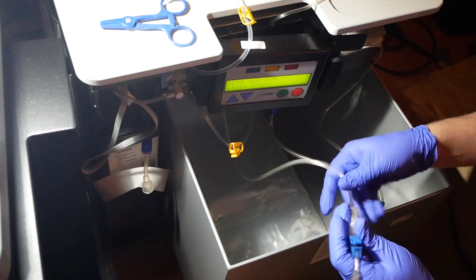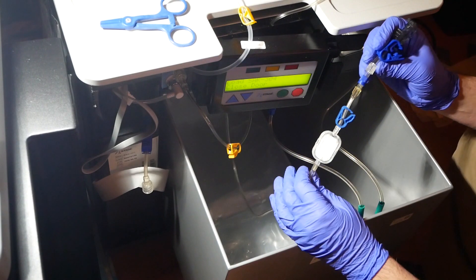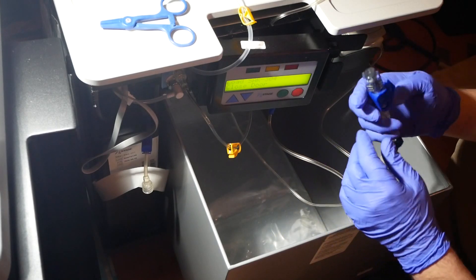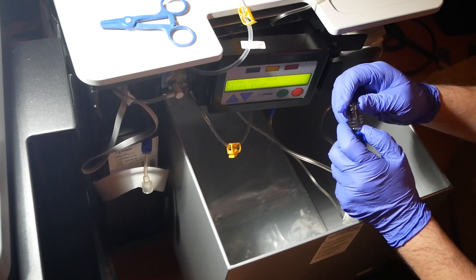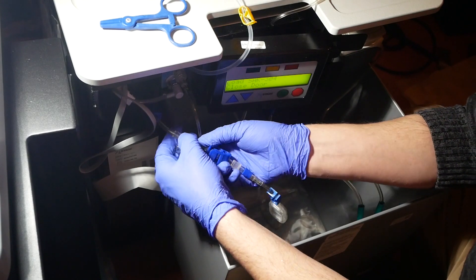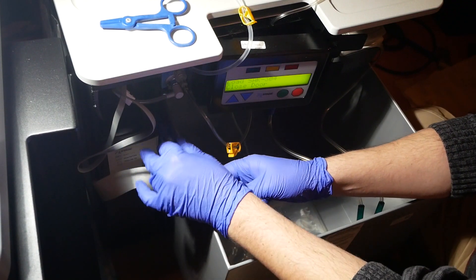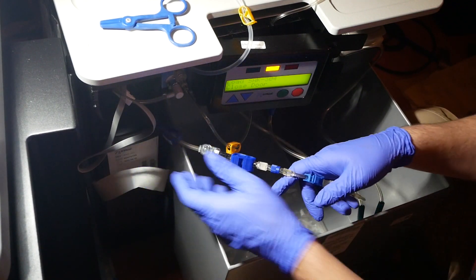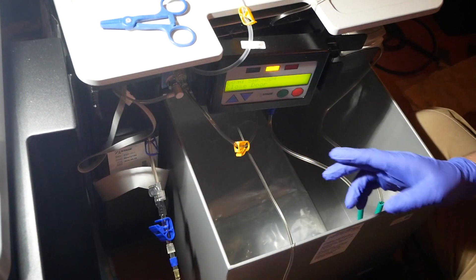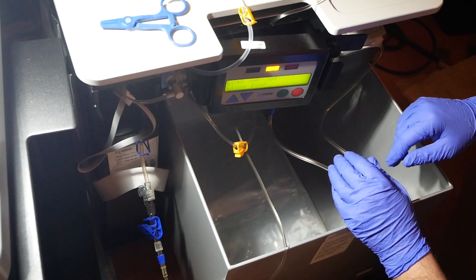Last but not least, we've got our blue line connector. This part is already here from when we removed the last sack - I just have to connect it over to my blue line. I flip this top up, bring it over, and screw that connector on. Then I unclamp the blue clamp we clamped when we removed the sack. I drape this around the corner just so it stays open and doesn't get a kink in the line.